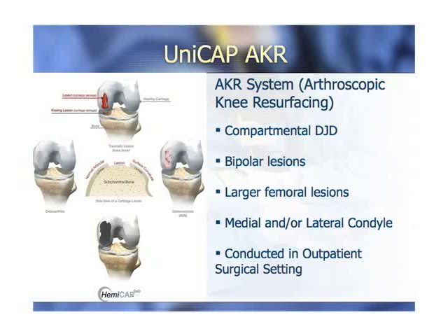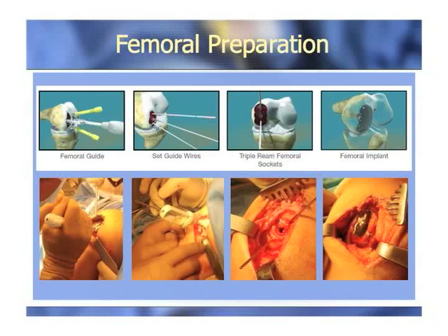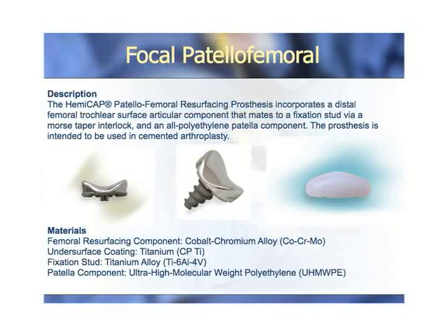And here's some examples of the technique that we won't get into now. We'll get into that in the lab, but here's an example of how the lesion can match the conformity of the condyle. The same can be said about the patellofemoral component.